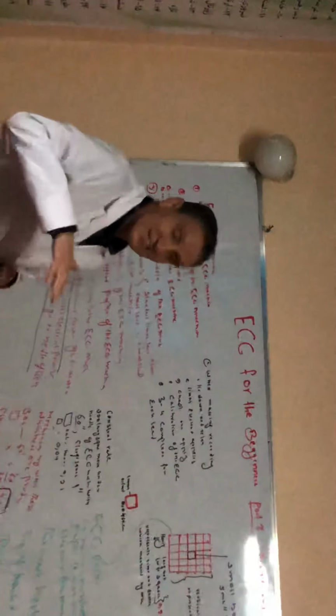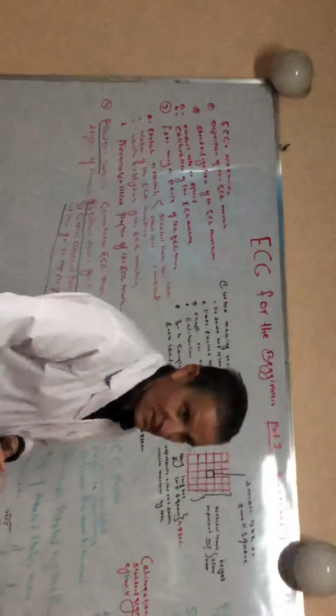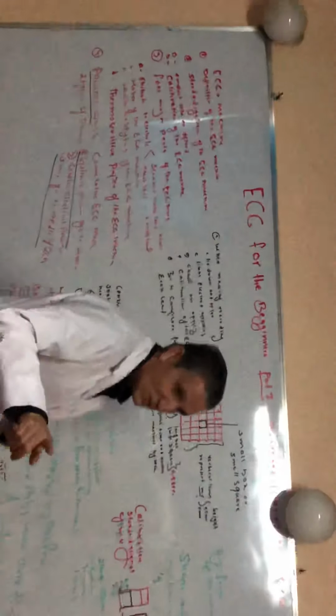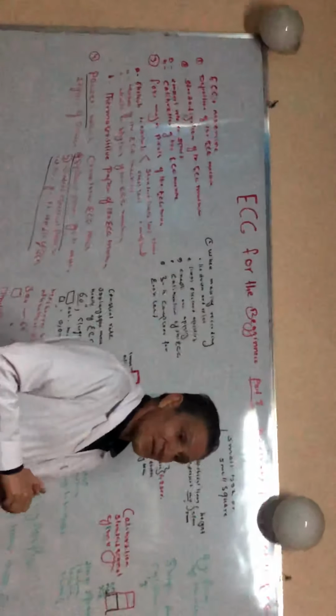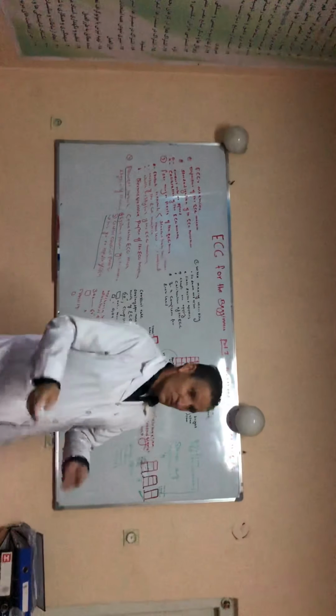It displaces the needle of the ECG machine vertically up to 2 large squares. These 2 large squares equal 10 millimeters, or 1 centimeter, and represent 1 millivolt. Every ECG should be adjusted according to the calibration signal. The calibration signal should be included in each recording of the ECG. When you take the ECG of Gulab, you should set this 1 millivolt. For another ECG, again adjust the calibration signal.